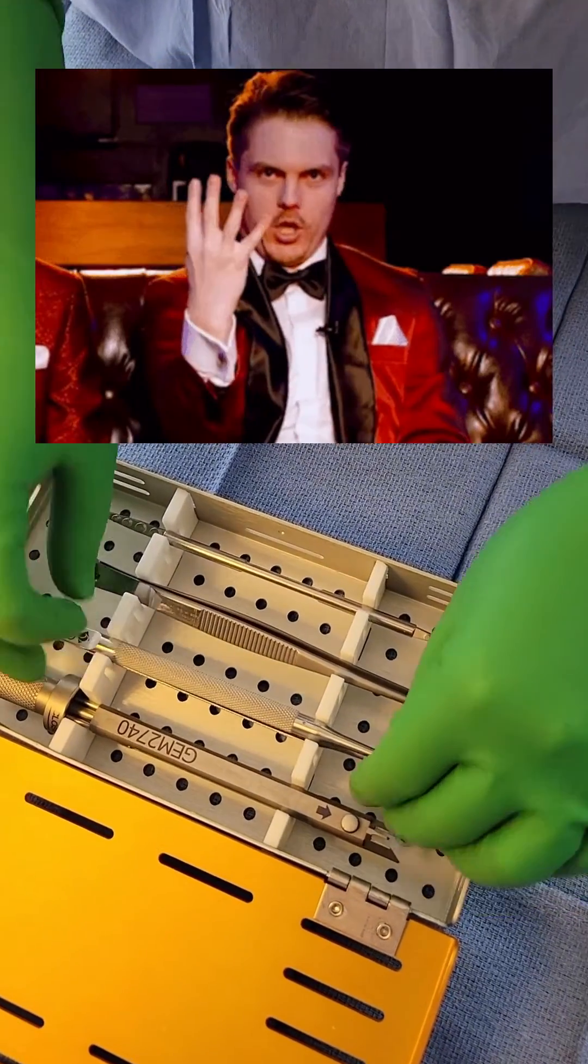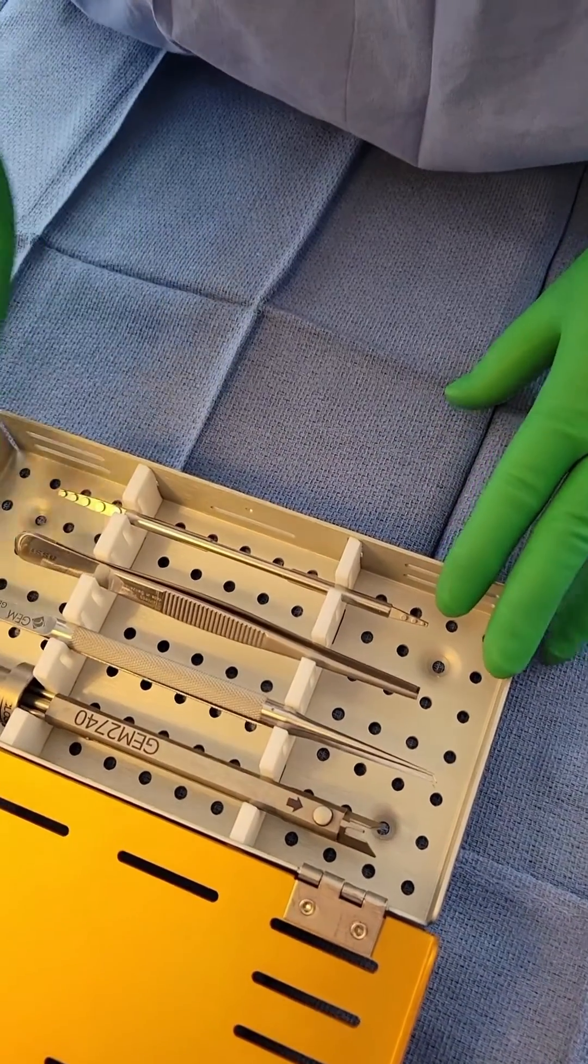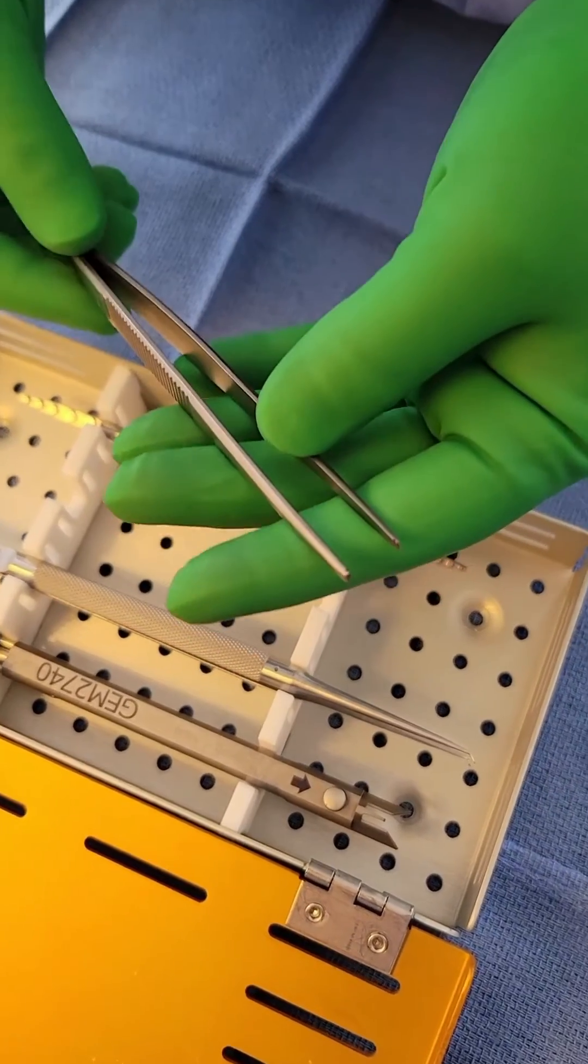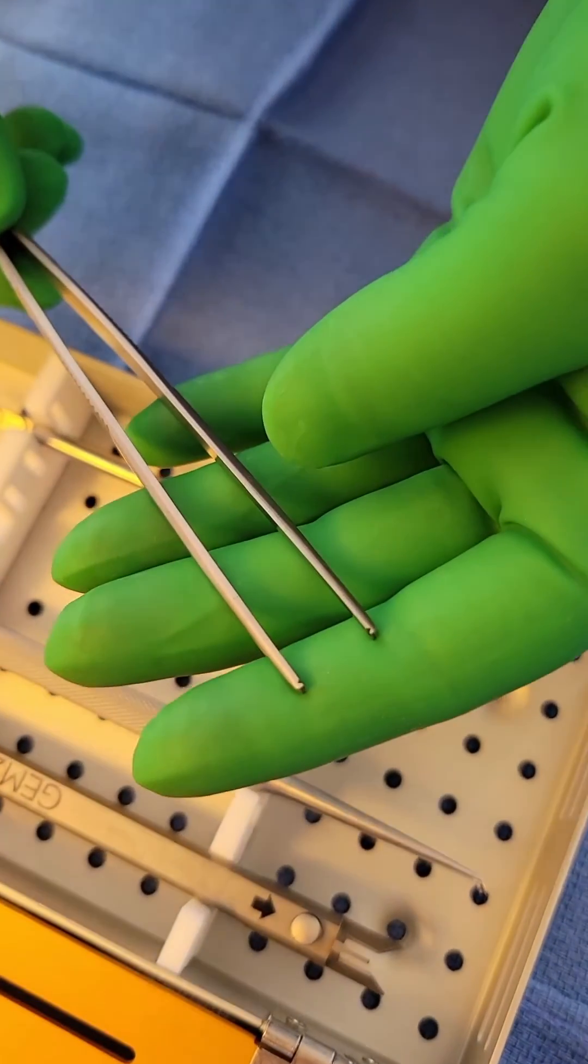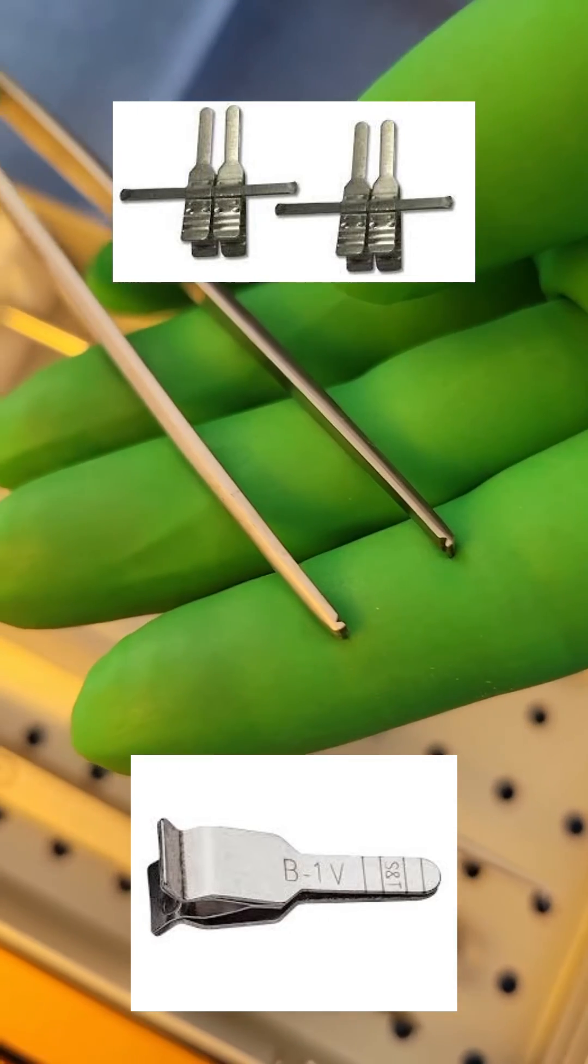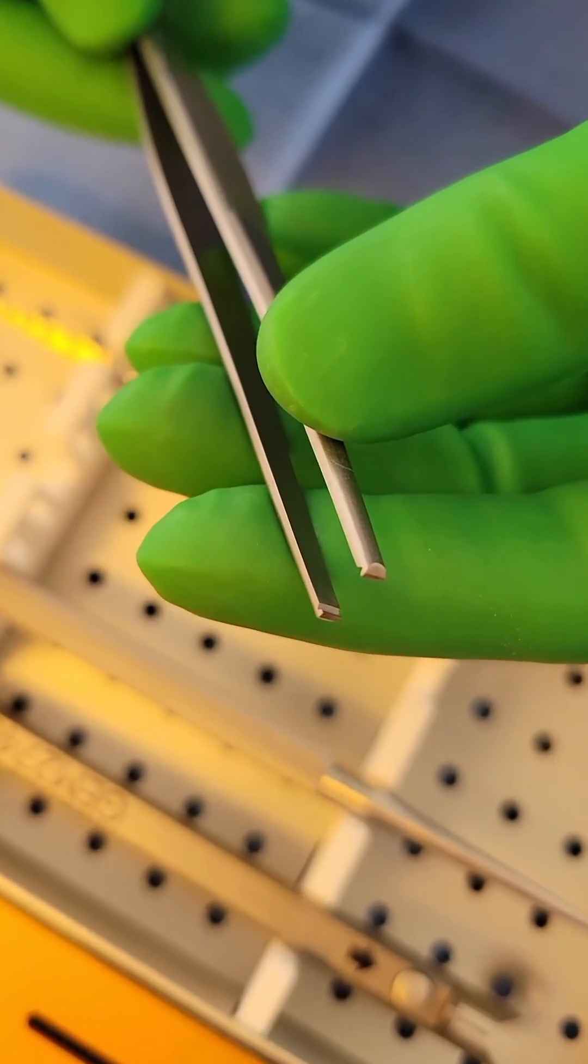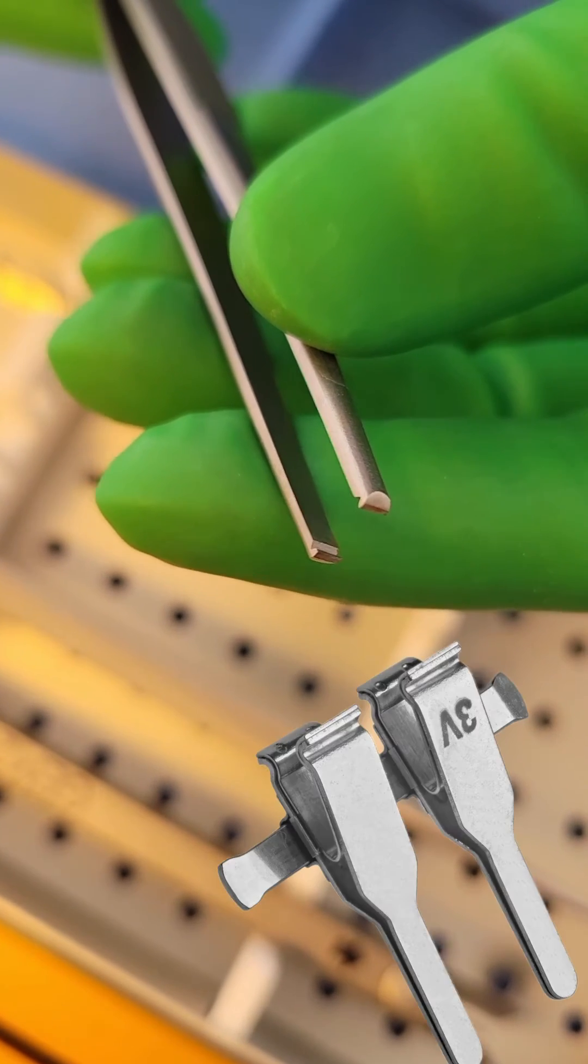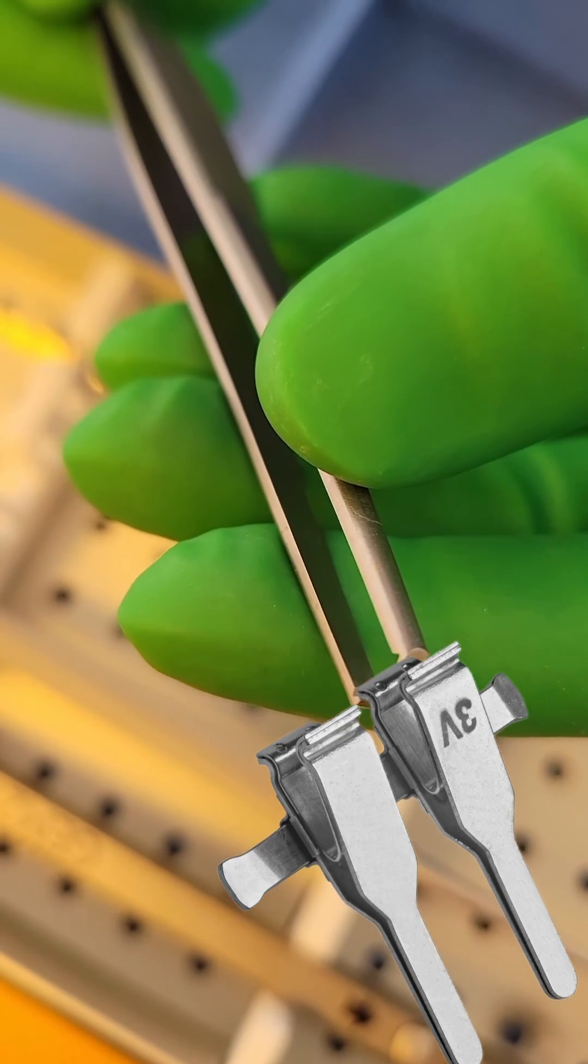Lastly, is the micro clip applying forceps or the Rizzuti. This is used to hold on to what we call bulldogs. If you watch my video on free flaps, we'll explain what bulldogs are. Right here, the notch in the forceps fits perfectly into the end of these bulldogs so the surgeon can apply them to the vessels with ease.